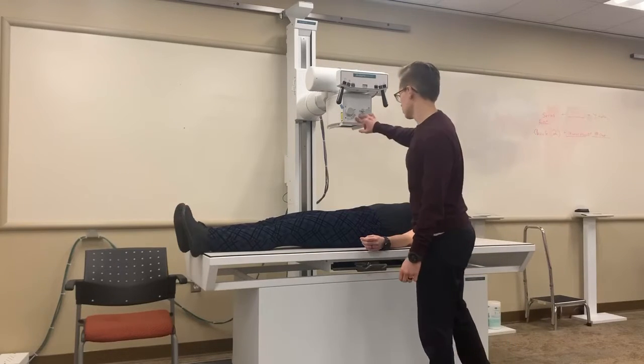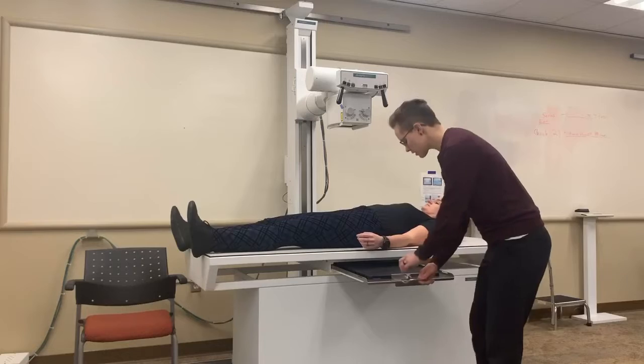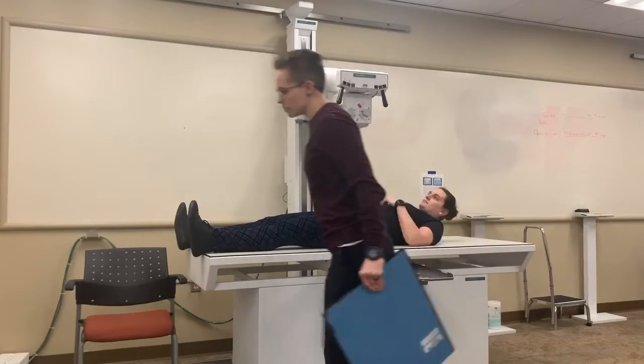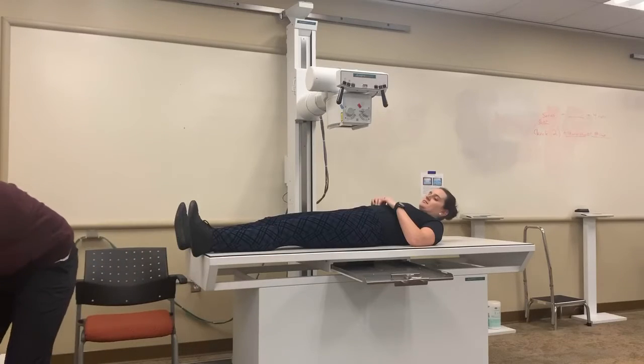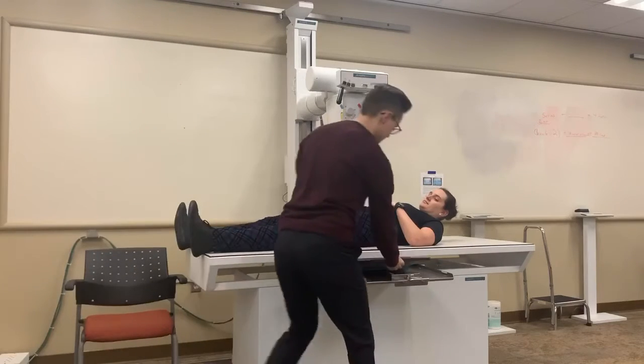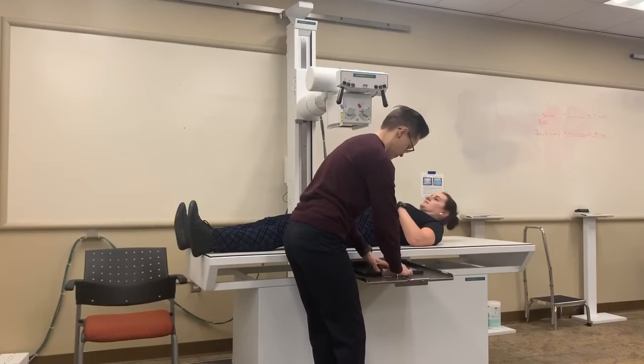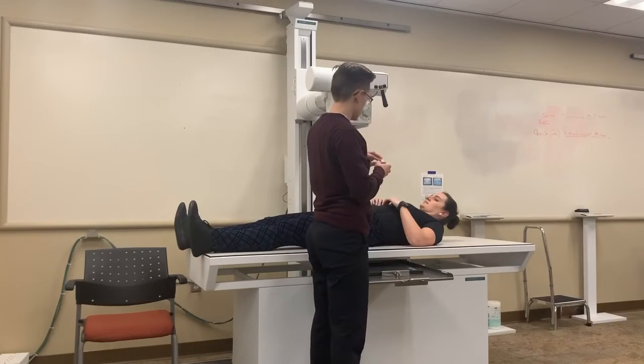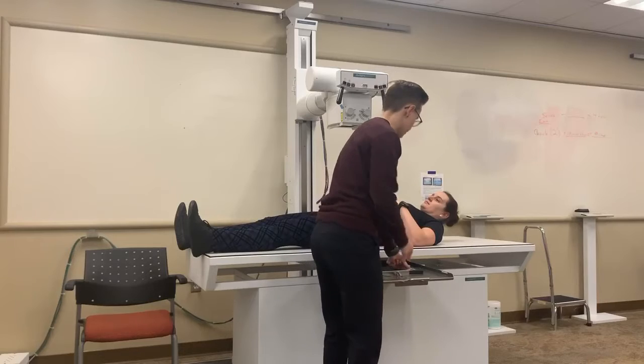You can relax. So if I do frog leg view, we're going to use a 10 by 12. Your patient is still supine. The ID blocker goes up. We're going to pretend that it is Dr. Zapay's right hip. That is the affected hip.